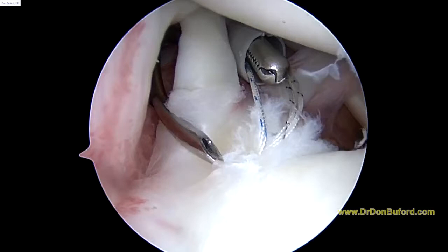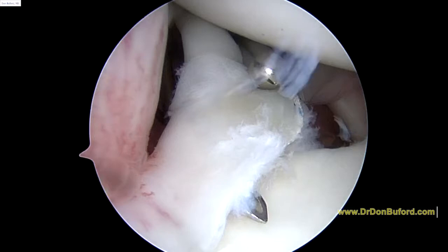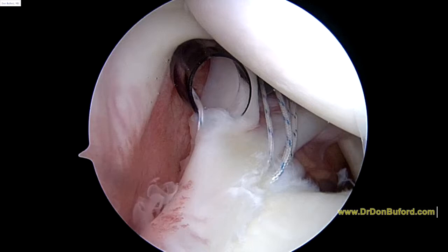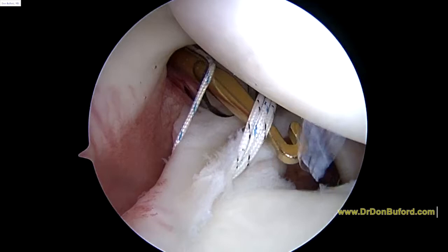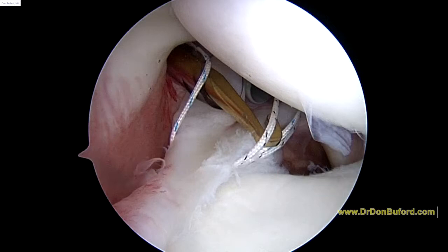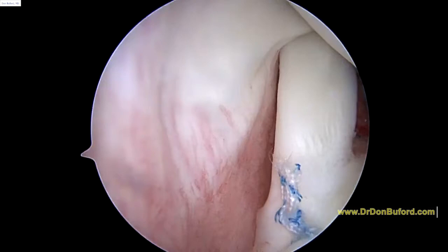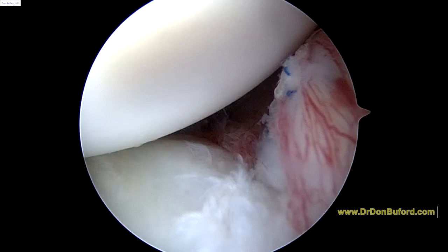With our clip, we're going to try and do a stitch just about like that. As we're pulling back, you can see how it brings that blue suture back behind the biceps. And now we've got to reach in and get the other suture. The first suture tied — you can see that holding it down. That's starting to look a little better. Just as a quick check, you can look down the back of the shoulder and you can see how much tighter that is compared to when we started.